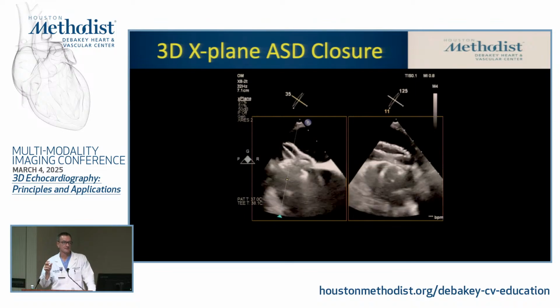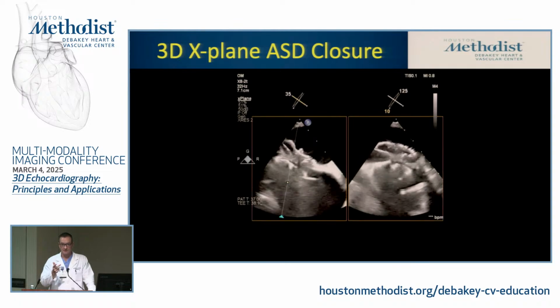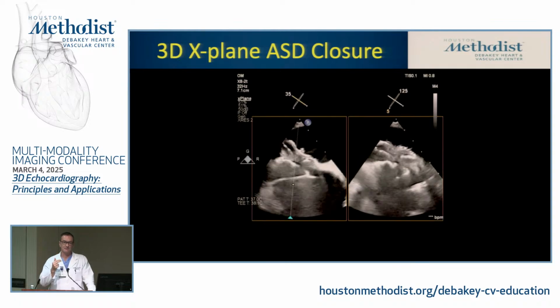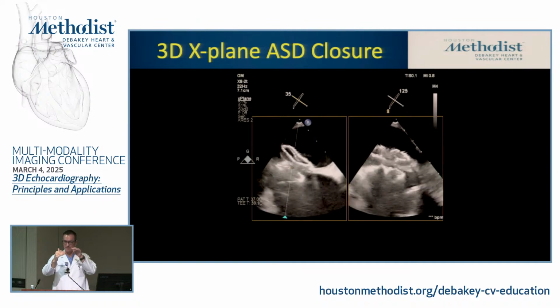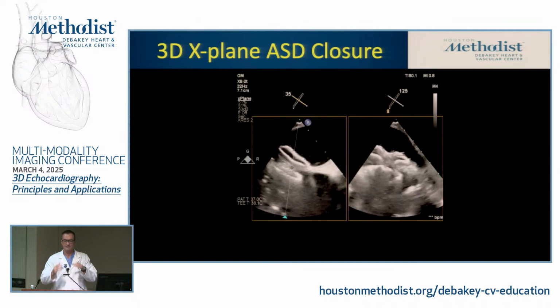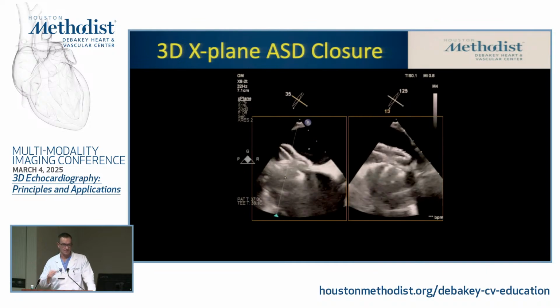So that's part of the math, when you put it in, recognizing it's not foreshortening, it's true shortening. So it's an imaging conference. The difference between foreshortening versus shortening. Foreshortening is an imaging perception, where you look at something at an angle and it appears to be a different depth or a different length than it really is. But when you are expanding a valve, you get true shortening, not foreshortening.